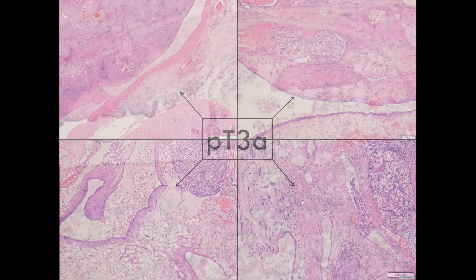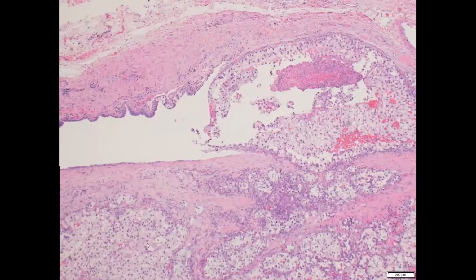And then lastly, it's been included that renal cancer, which directly extends and involves the pelvic calyceal urothelium, should also be classified as a T3A. So here in this example, you can see there's even a pagetoid spread in the calyceal urothelium over here. So in most cases that involve the renal sinus and then involve the pelvis are also going to involve the renal sinus. So that's easy to diagnose as the T3A in that setting. But in some cases, in the smaller calyces, you can have direct contact of the kidney with the calyceal system.